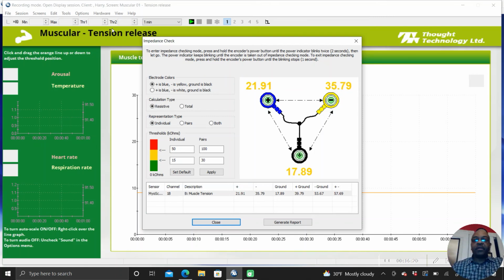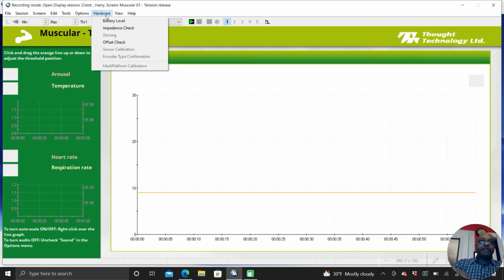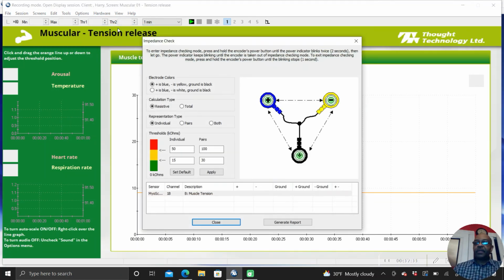The main thing I wanted to do is just show how this impedance test sensor works, which is what I was able to do. And also, I just want to let people know that this sensor costs about $100 more than the type of sensor that does not have the impedance test. But as you can see, there could be a big difference in your impedance levels depending on the different types of sensors you use, depending on the disposable sensors, depending on the electrical contact based on the skin prep, cleaning the skin, and those kinds of things, what a person might have on their skin.